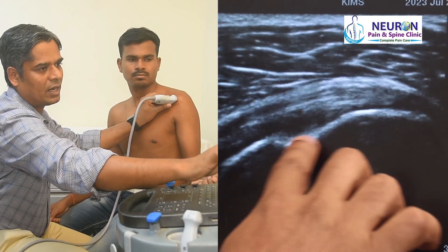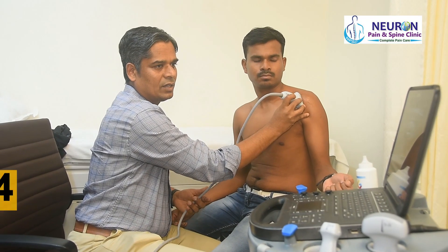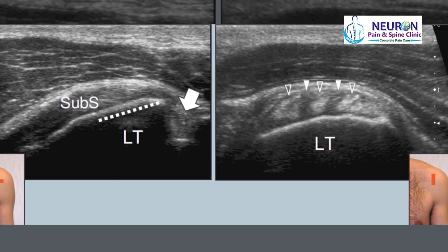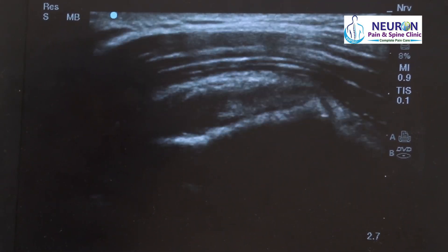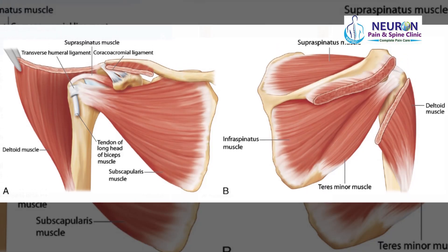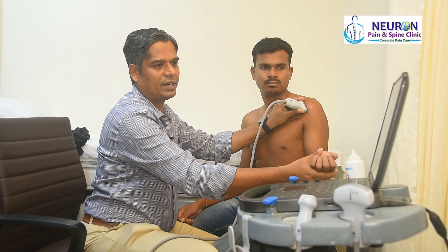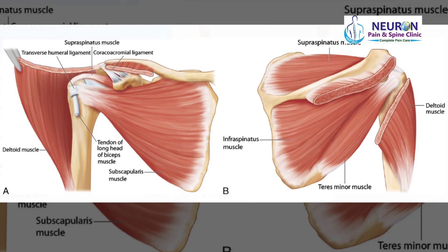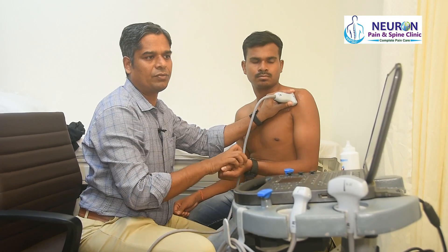From here you can see the articular cartilage at the insertion. Step four: I rotate 90 degrees to scan in short axis. In short axis, this tendon has a multi-pennate appearance — one can see two to three different pennae with some hypoechoic tissue in between, like multiple tendons with muscular tissue in between. The tendon looks normal here.